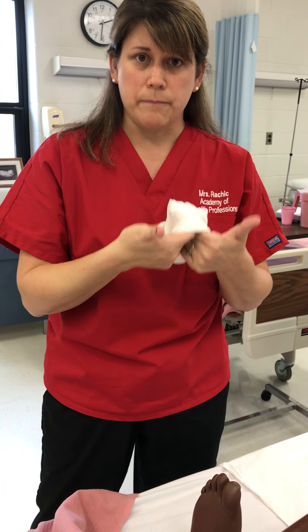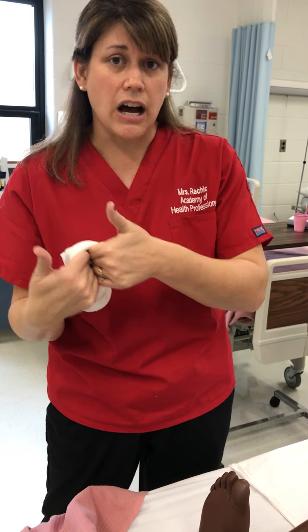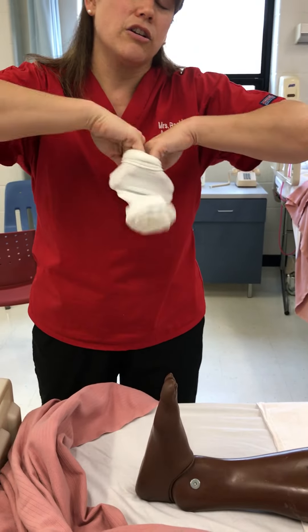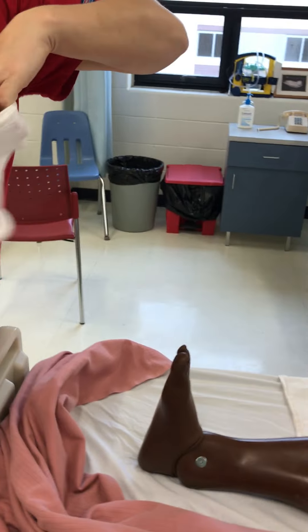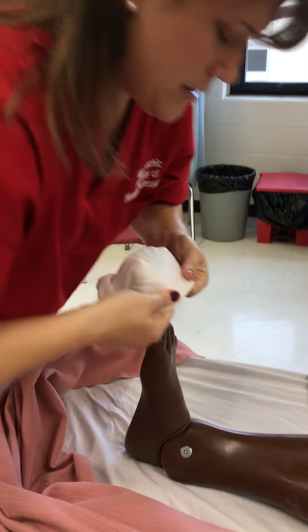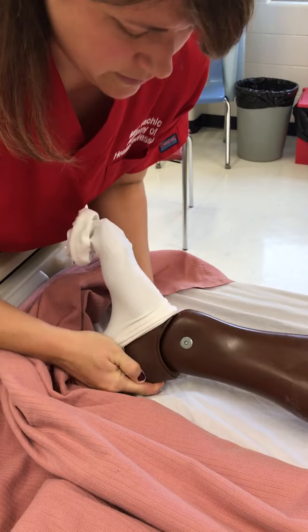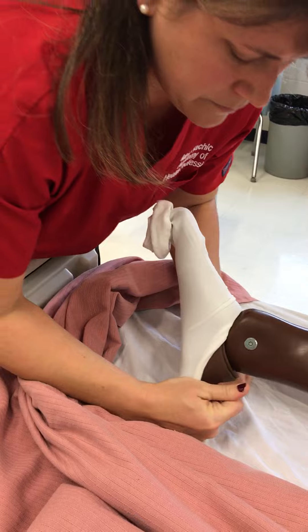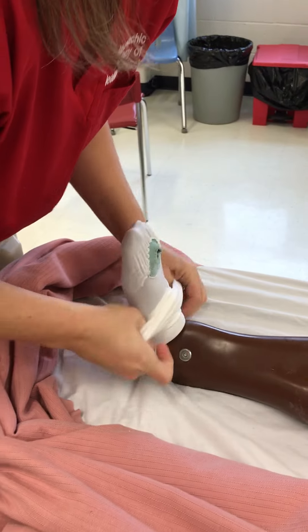Set up with this skill is everything. If you're struggling and you're not able to get this TED hose on the patient, don't struggle — take off the sock and reset it up correctly. When you put it on, you're going to put it on over the toe and work until you get it over the heel, then pull it up the leg. This one's really tight and the mannequins are really hard. Ms. Hudson, I'm going to go ahead and put this on you. Get this over your heel. There we go. Once you get it all the way over the heel, now I'm going to go ahead and just feed this over top.